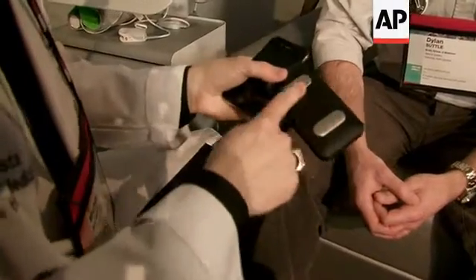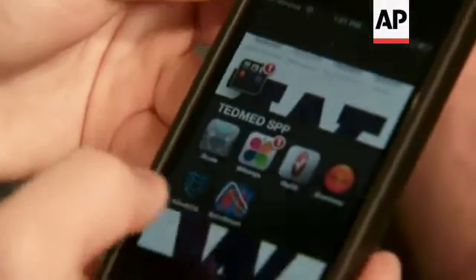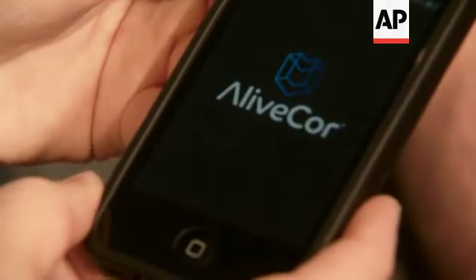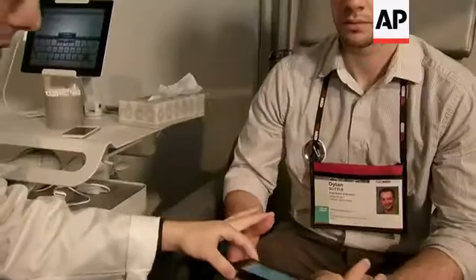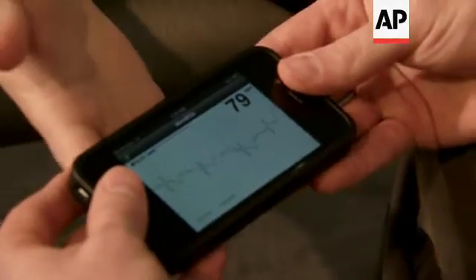It's an iPhone case with two electrodes on the back. Now we're going to snap the iPhone into the iPhone case. We're going to use the AliveCore ECG application to allow us to look at your heart activity.